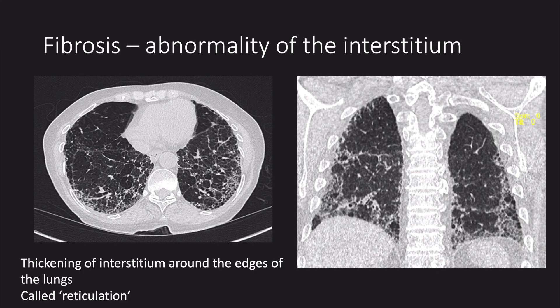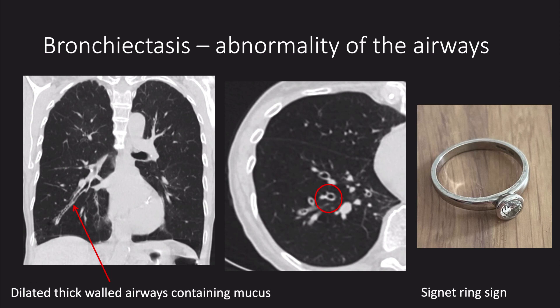Moving on to diseases of the interstitium. This is an example of pulmonary fibrosis — thickening of the interstitium produces a lacy appearance called reticulation, leading to shortness of breath as the lungs lose elasticity as they become progressively scarred. Finally, bronchiectasis is an example of an airways disease, characterised by dilatation of the airway so it's larger than its accompanying artery. Thickening of the bronchial wall alone does not mean there's bronchiectasis — the airway has to dilate. It's called the signet ring sign, as the circle of the dilated airway looks like a ring and the smaller white artery, the stone.